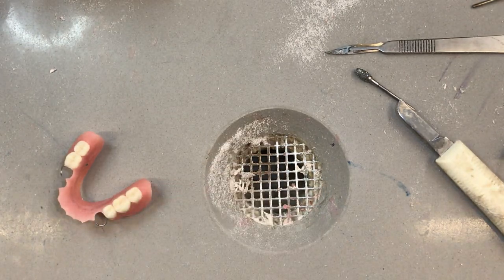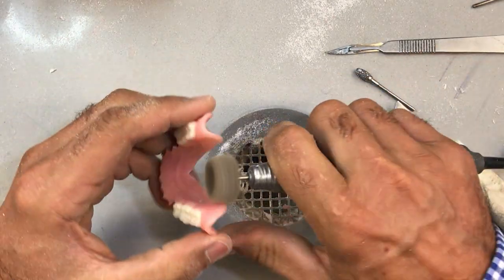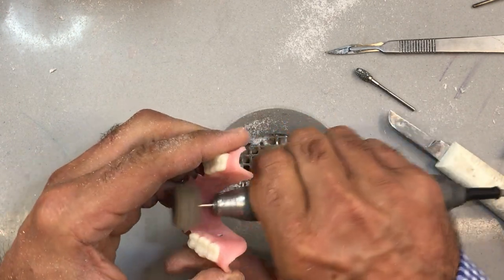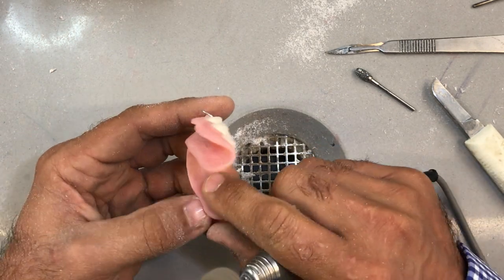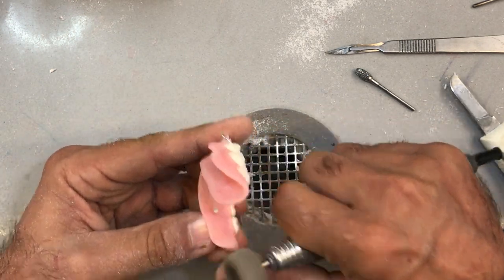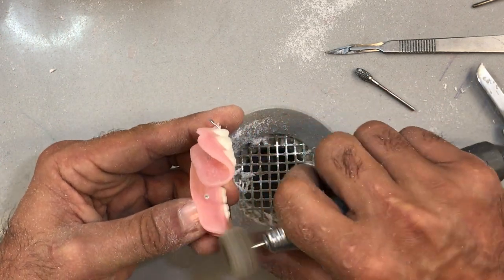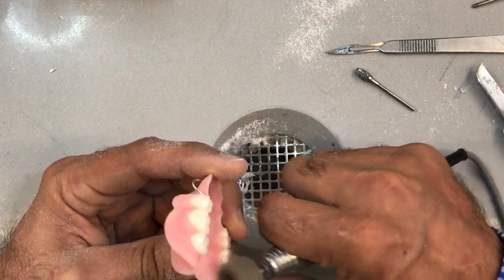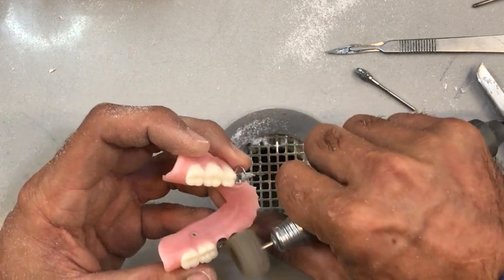The last little bit before we go to polish — before I go to polish, I still have to cold cure those areas over the extension of the reinforcement, which I will show you on another video.